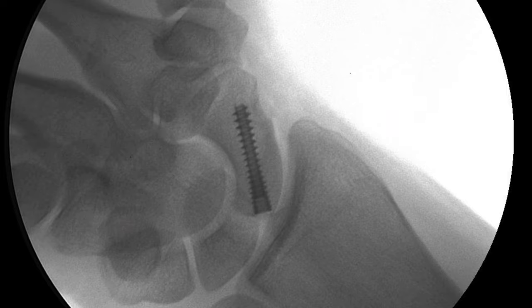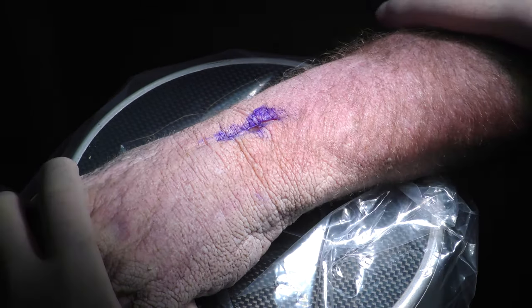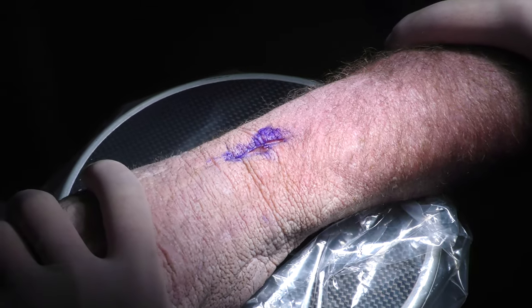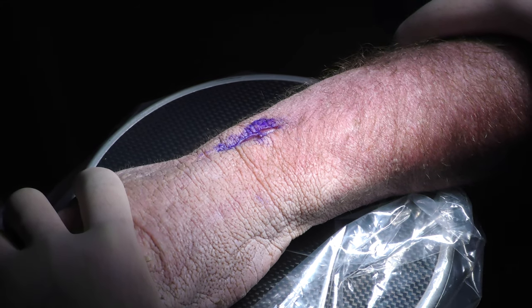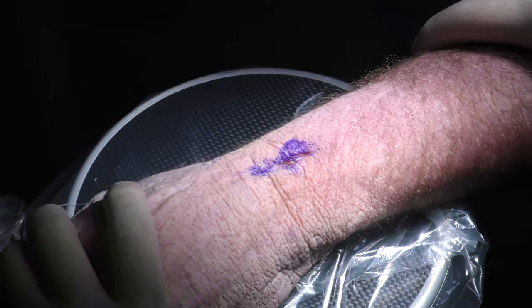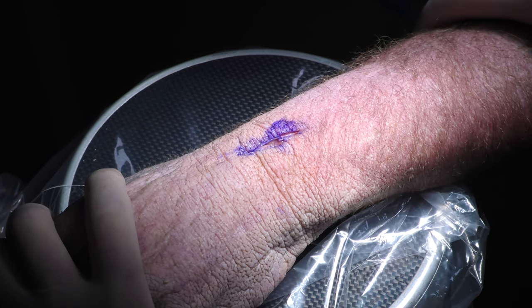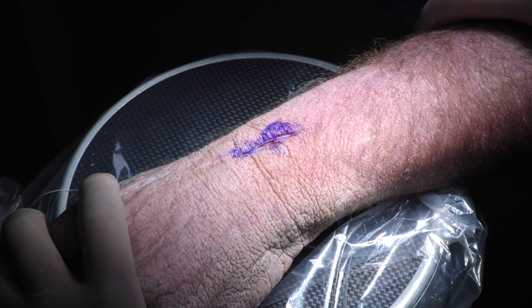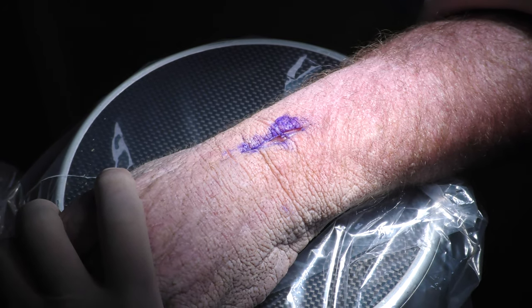At the end of this case, you can do a capsular closure. I usually use a 3 or 4-0 PDS suture for the capsule, and then I close the skin with 4-0 nylon, and they can go into a removable splint at the end of surgery. And I have them back about a week after the procedure, and I put them into a removable wrist splint and begin range of motion exercises.